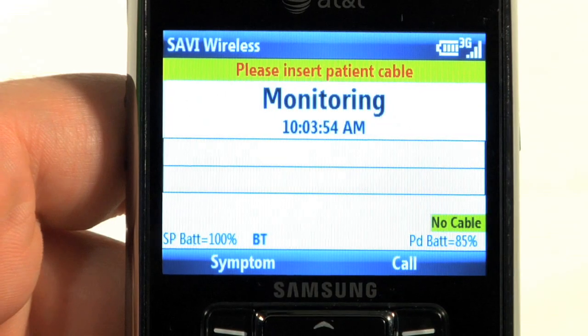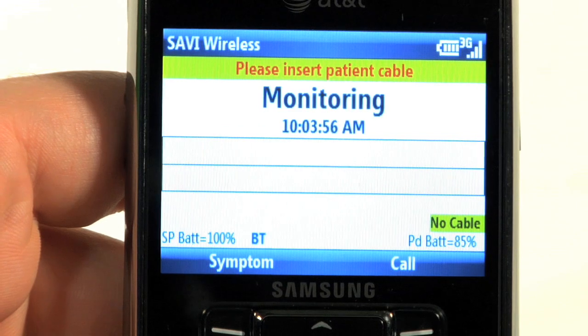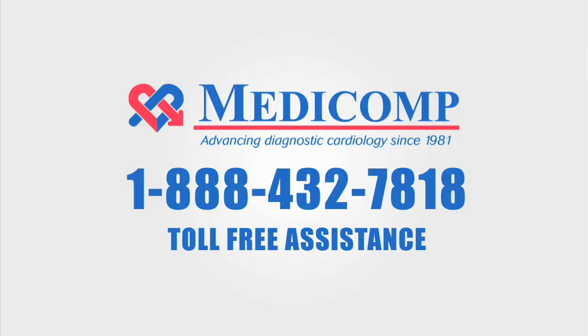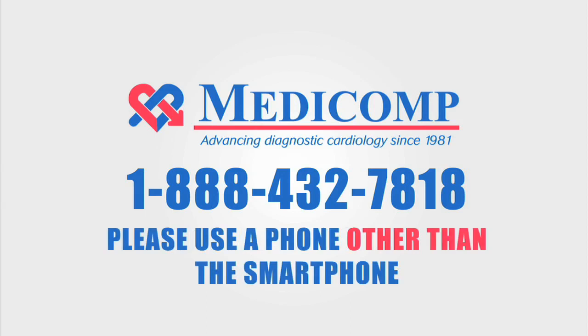If you see something other than 'Monitoring,' leave the electrodes on your skin for 15 minutes and try the setup again. If you need assistance with your procedure setup, please contact Medicom's cardiac monitoring center 24 hours a day, toll free at 1-888-432-7818, using a phone other than the smartphone.